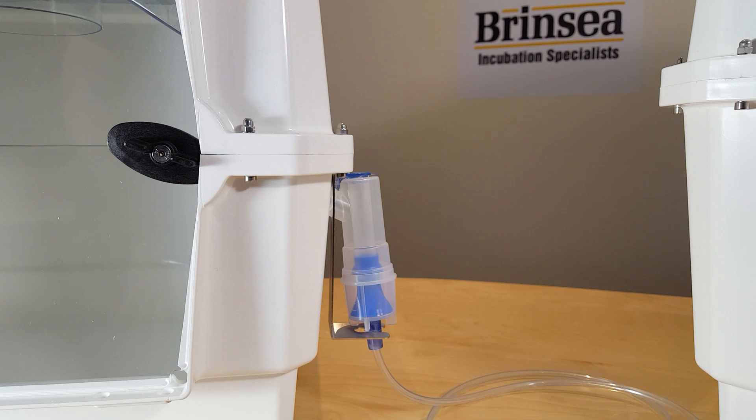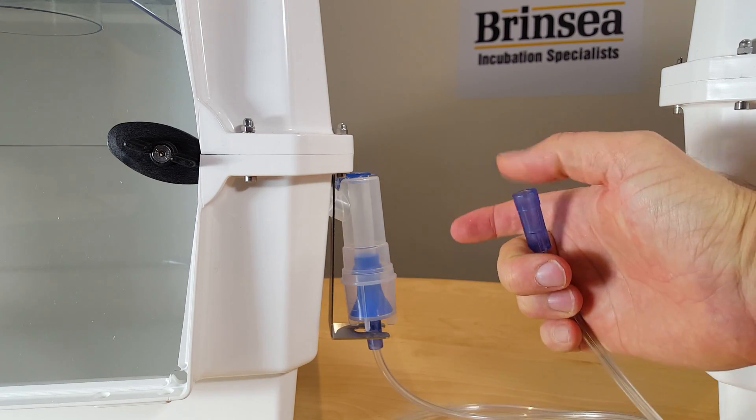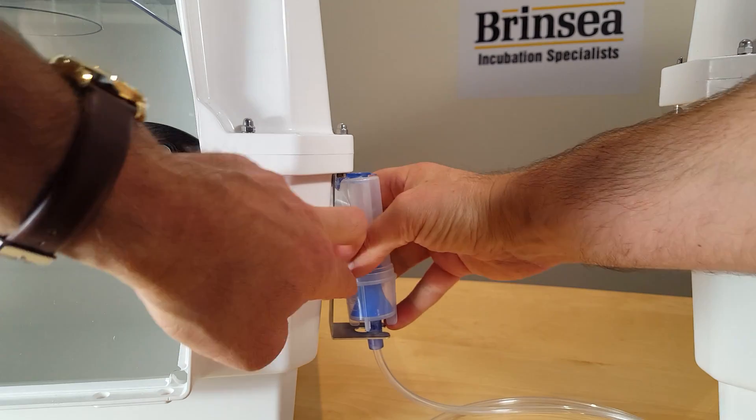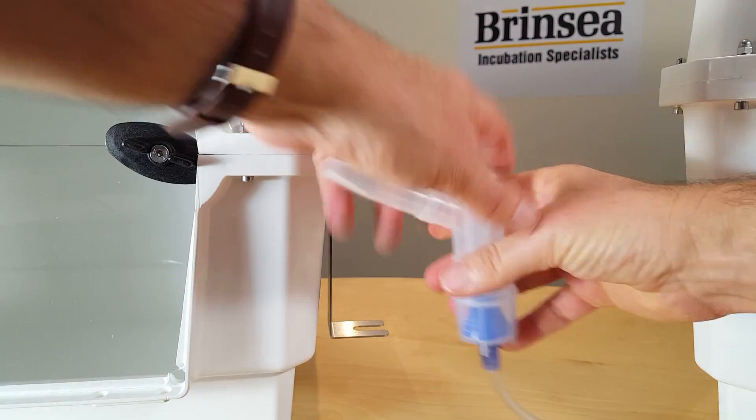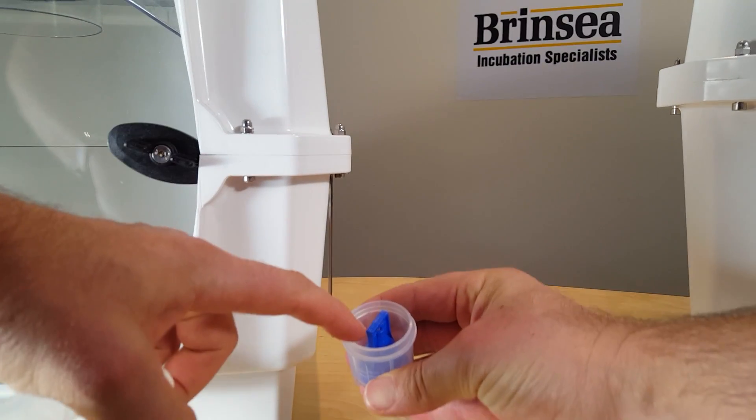Vets will also tend to have their own nebuliser pumps and these can be connected to the medication reservoir at the end of the tube here. The medication reservoir itself can be unclicked from the machine, taken apart, and medication can be added.